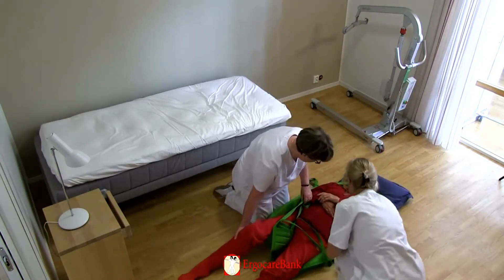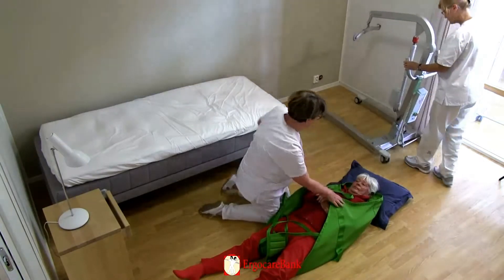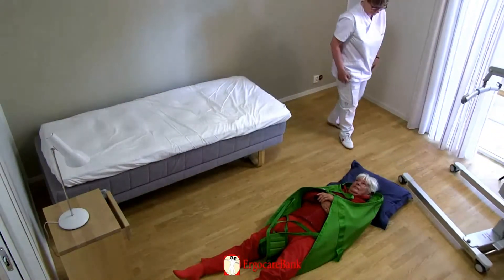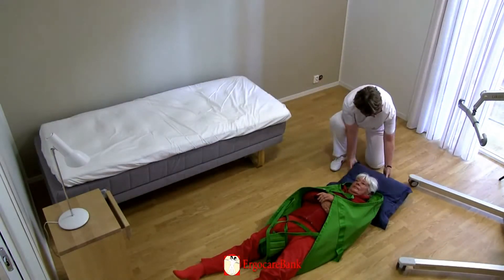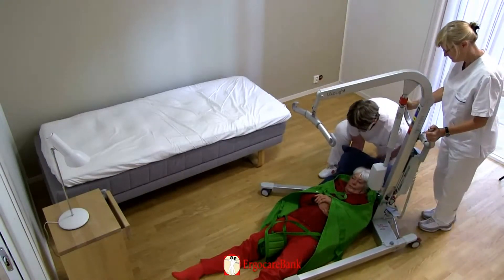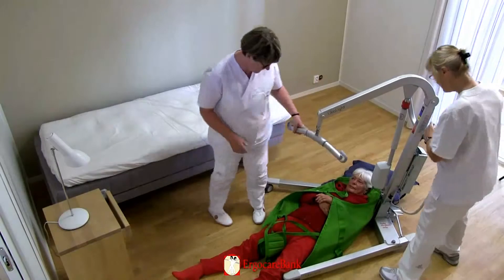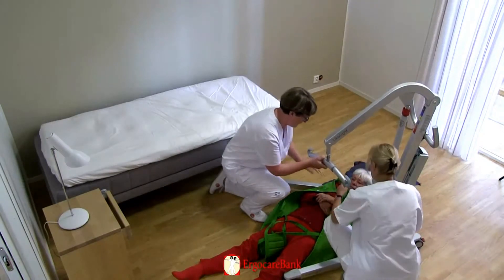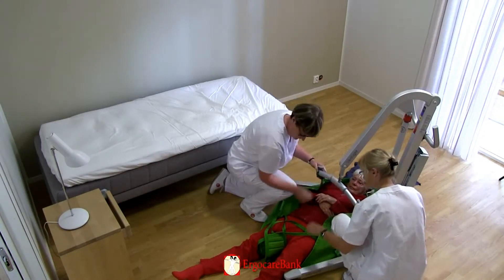The staff pull the sling through underneath Celia and straighten it. The leg straps of the sling are crossed. The staff bring the hoist in from behind Celia's head. The legs of the hoist are spread and carefully positioned so that Celia's head can be placed on a pillow onto the inside corner of the lift's legs. The staff position the spreader bar of the hoist across Celia's body and lower it so that the straps of the sling can be hooked onto the lift — the upper straps first, and then the lower.